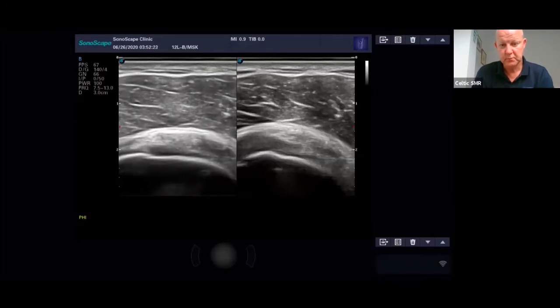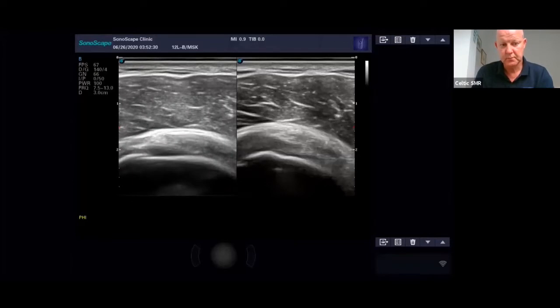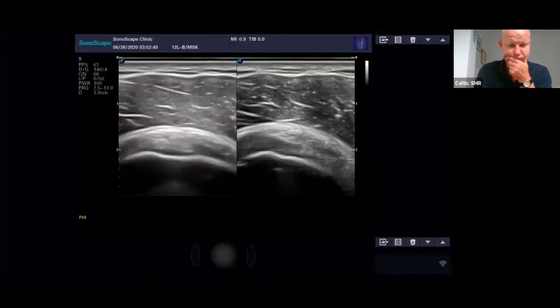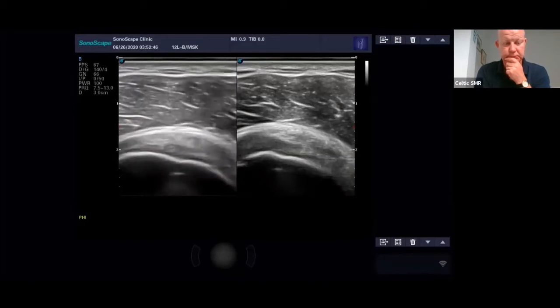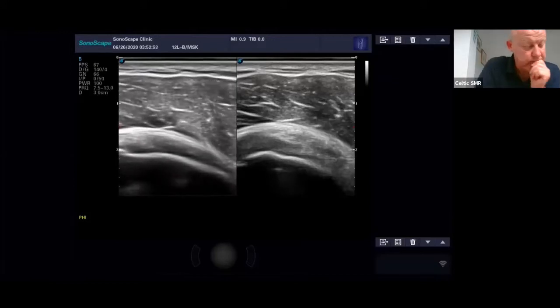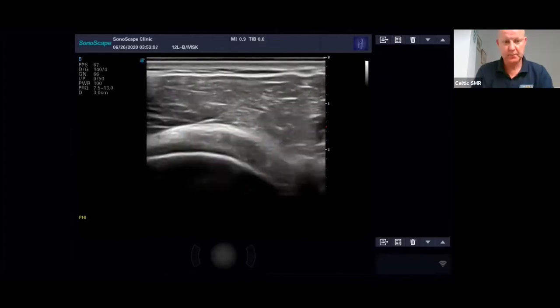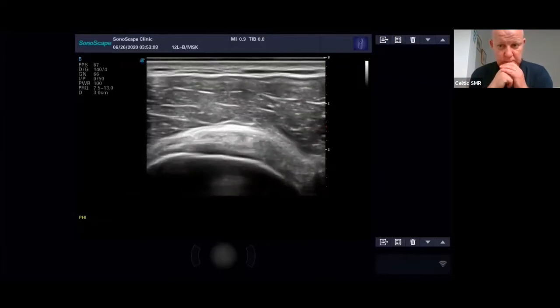Would you recommend the audience that are starting scanning measure them first, or do you think it's good enough to eyeball it? Can you see pathology clearly if you're measuring? You could. The trouble is, everyone's going to have different tendon thicknesses, I would think. So, yeah, you could measure it and compare with the other side. Just make sure that when you do that, you get it in the same plane. So let me go back. If you're measuring one place, make sure you're measuring it in the same place. So get to a level where you want to measure. Let's just say it's there, and then just make sure you get the same image on the other side.